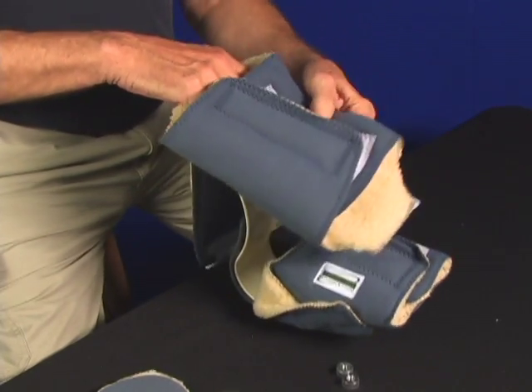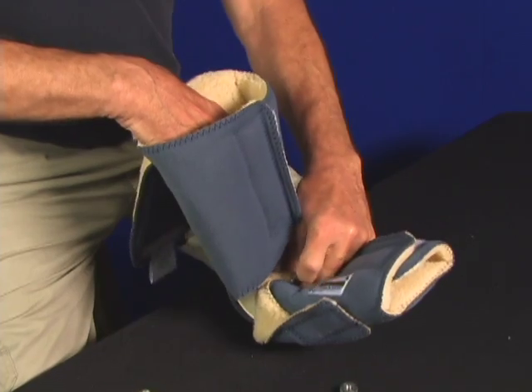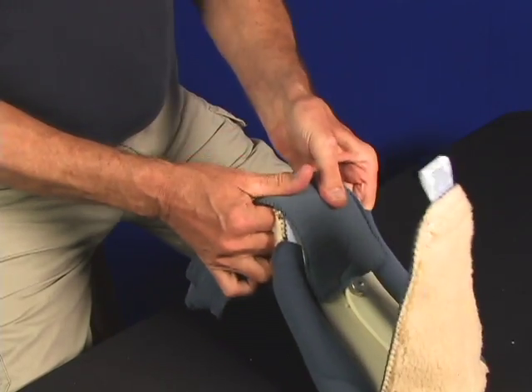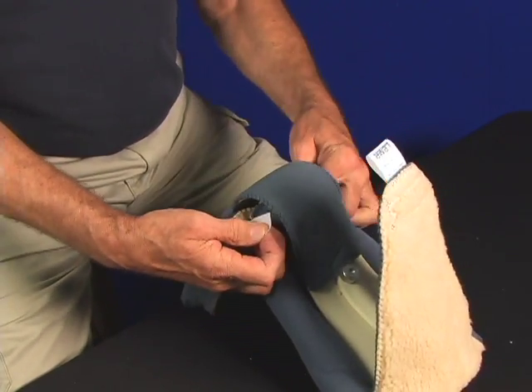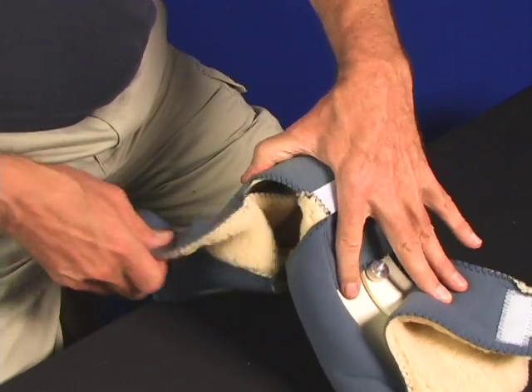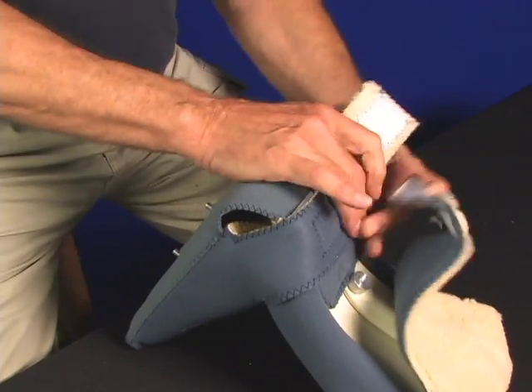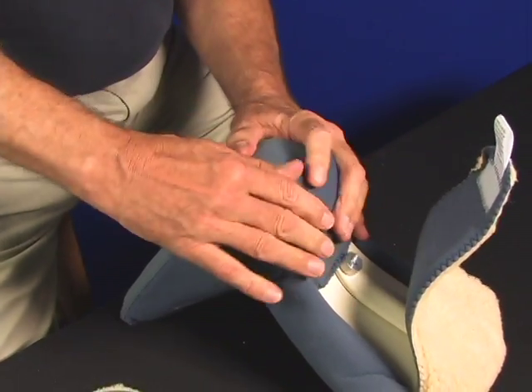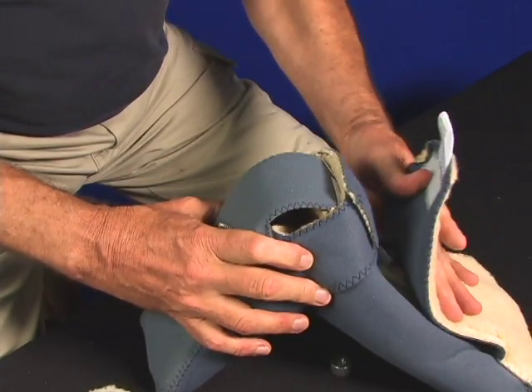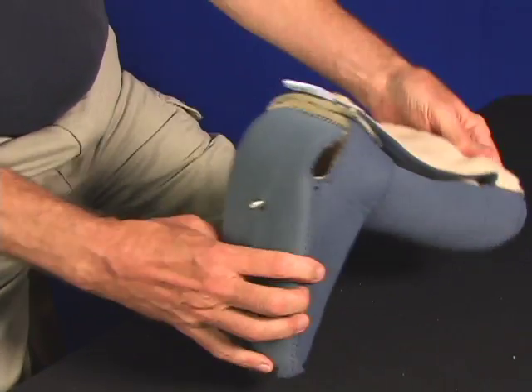Push the cover down against the very top of the shell. Engage the front of the cover with the Velcro on the front of the Kydex shell and smooth it down to the very bottom. Now turn the boot upside down again to access the locking Velcro tabs. Lock the small tabs in place on the tongue of the bottom cover, then wrap the large tabs from the bottom cover around the heel to cover the small tabs. Note the heel viewing port used to check the patient's heel. Smooth the back of the top cover down, covering the anti-rotation bar. Everything is covered — no plastic is exposed, protecting you and your patient.